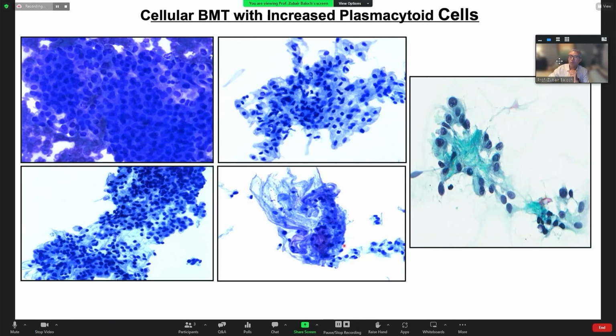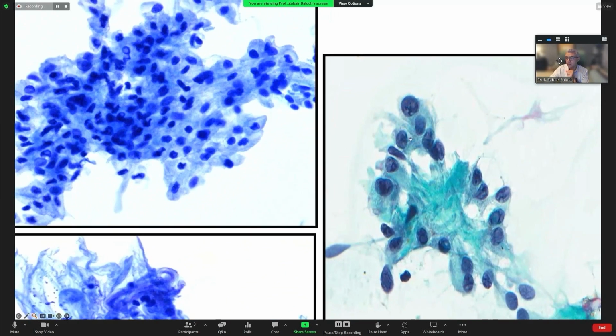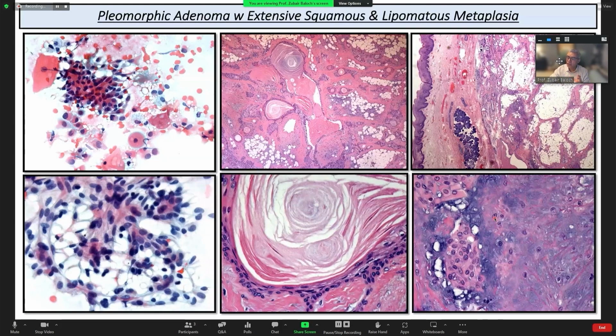The other thing I want to point out, which is very important, is that when you get these tumors, look at the cells, and sometimes the cells can have beautiful intranuclear inclusions. That is very typical of myoepithelial cells. So this is one of the cases which was very cellular, so these tumors can be cellular. In rare instances, these tumors can undergo squamous metaplasia and can actually have keratin in them and can be mistaken for a mucoepidermoid carcinoma or even a metastasis or a squamous cell carcinoma.